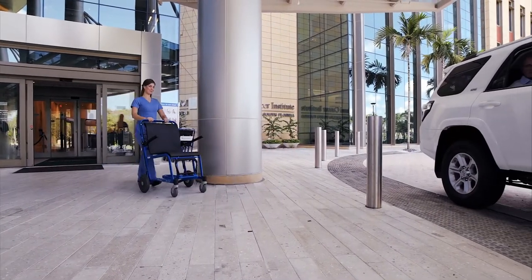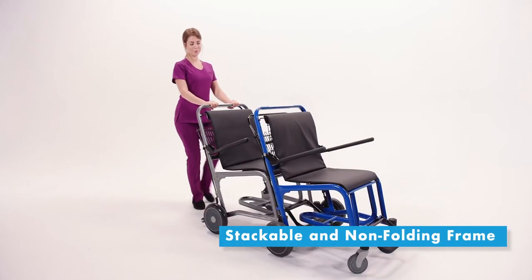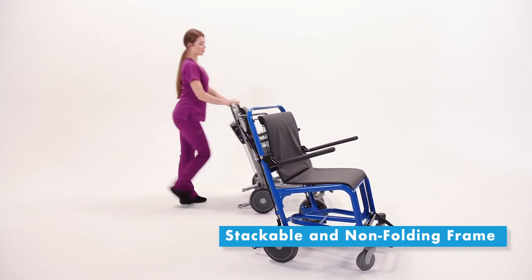The height of the back of the chair is designed to afford the attendant a comfortable position to engage the chair without stooping, reducing stress and pain on the attendant's back. Staxi is easy to find and they even nest together. Each Staxi is 39 inches in length, and as they nest, each subsequent chair adds 12.5 inches to the stack, saving space and eliminating scattered chairs.